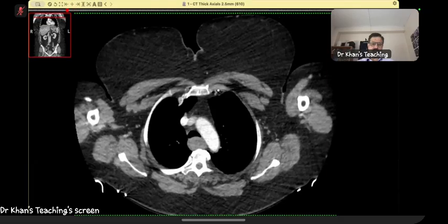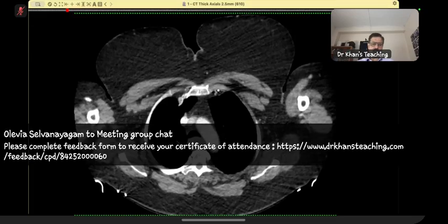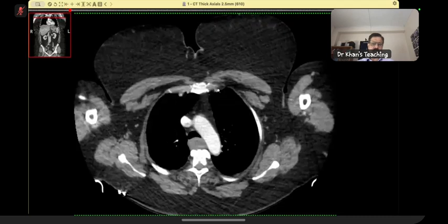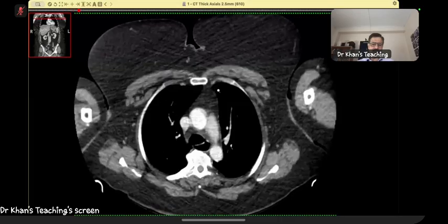Now, in the wall of the esophagus, the differential diagnosis will include, you were absolutely spot on, leiomyoma, which is fine. You also mentioned lipoma, which is fine, and you disregarded it because it was not fat density. But other than that, GIST is there, and then neurogenic tumors, they can be there.